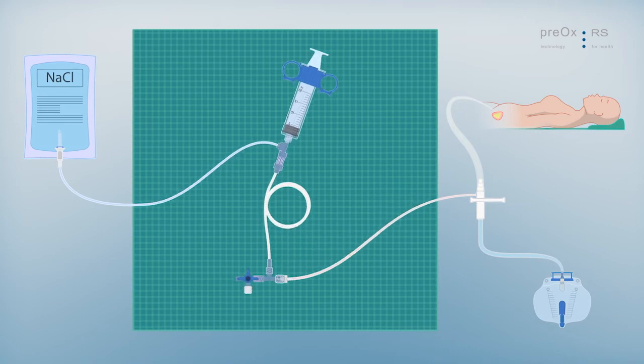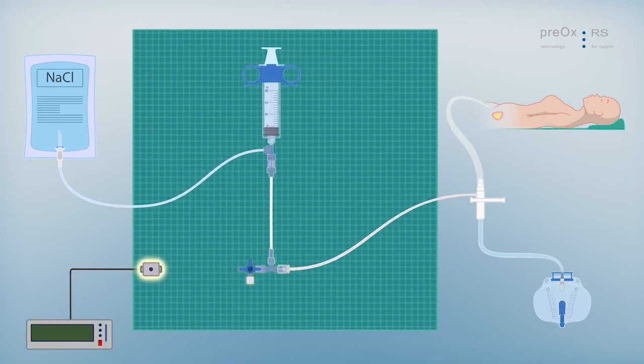Finally remove the yellow clip and connect the three-way stopcock to the pressure transducer.